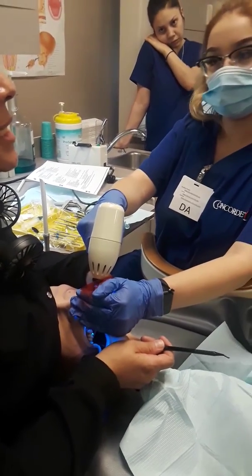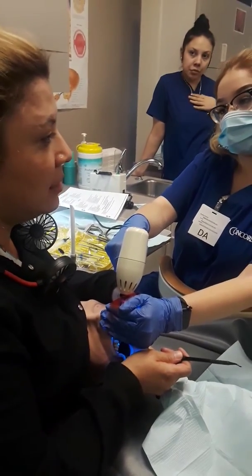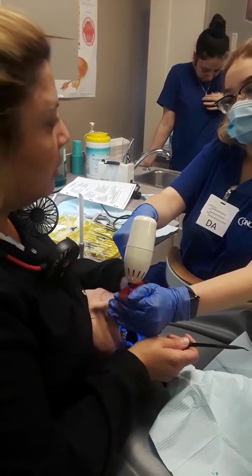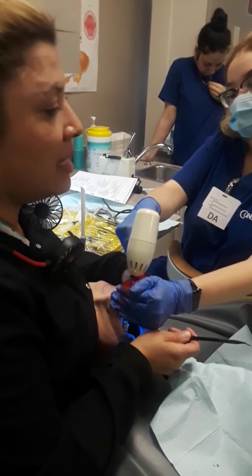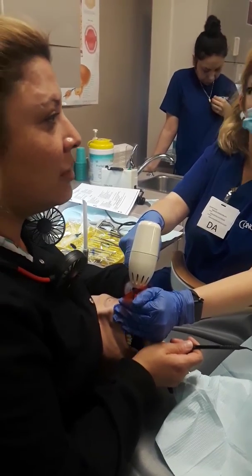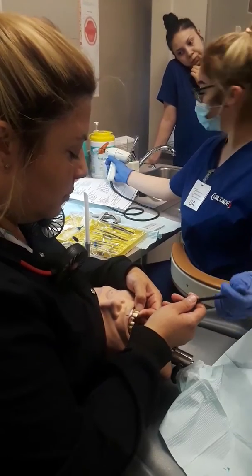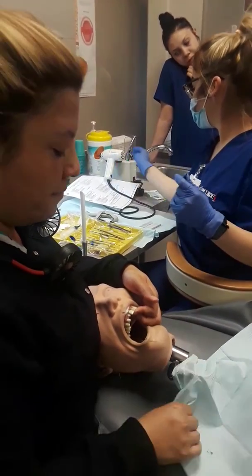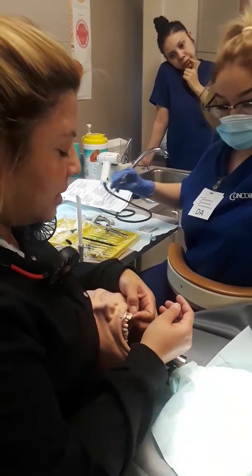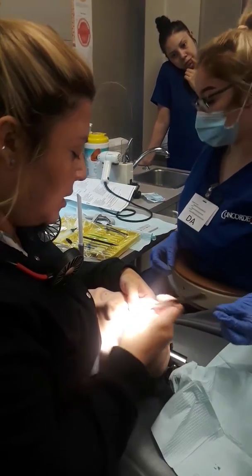A contact means your teeth are touching — you don't want spaces. You want your teeth to touch tight. The tighter it is, the less food catch. Next step: remove matrix and wedges — she's going to pass the cotton plier so I can take them out.